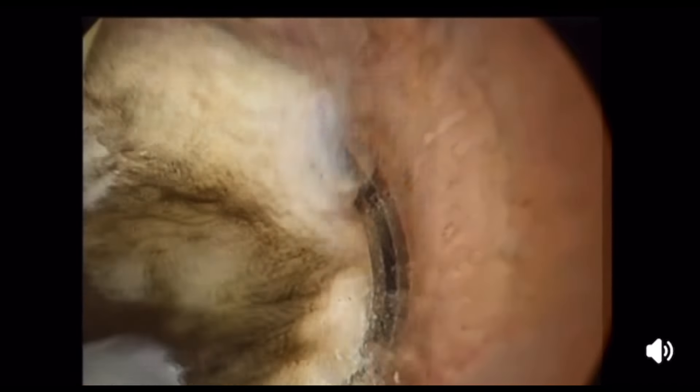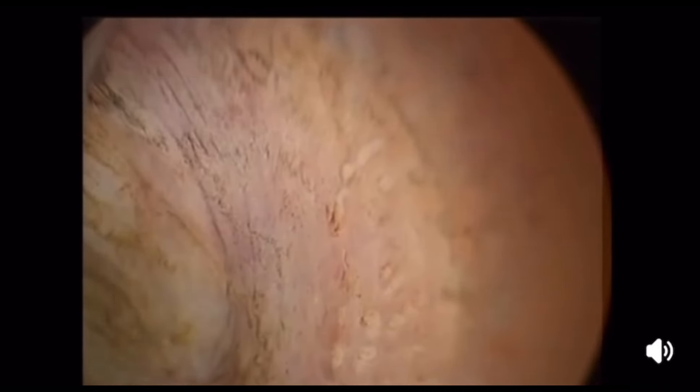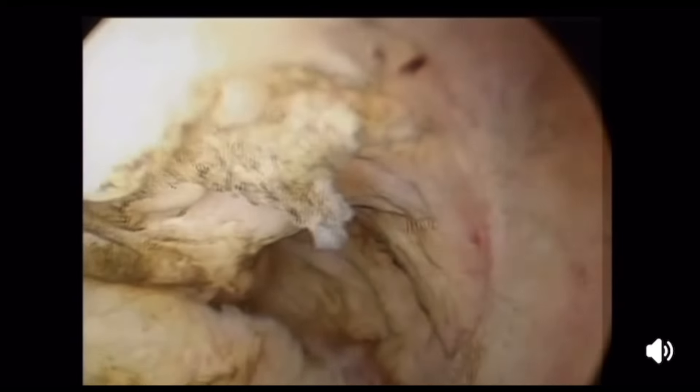I invite each and every colleague viewing this video to focus and imagine, and try to move your fingers, move your hands, rotate your wrist — so you can replicate the same movement. Here I start resection of the most inferior part of the myoma.